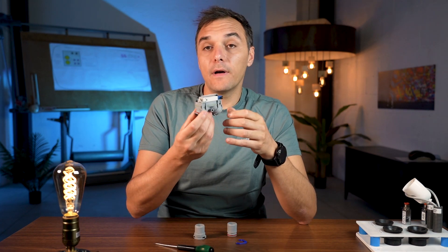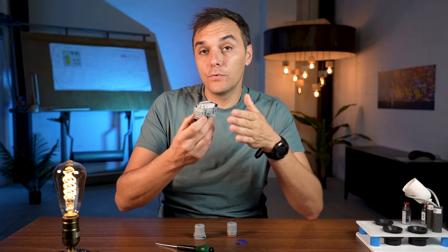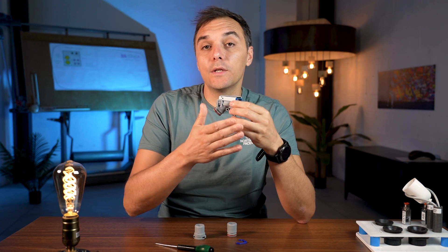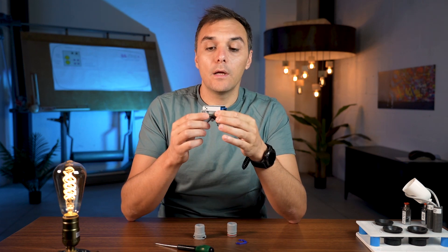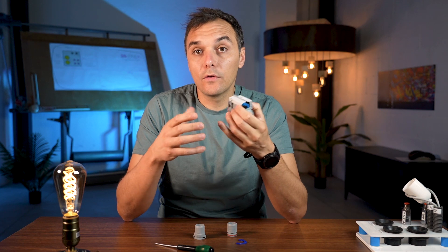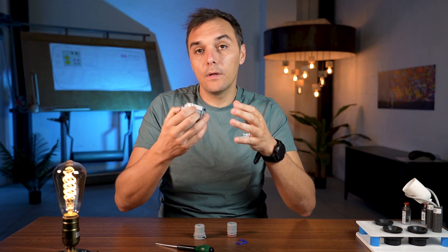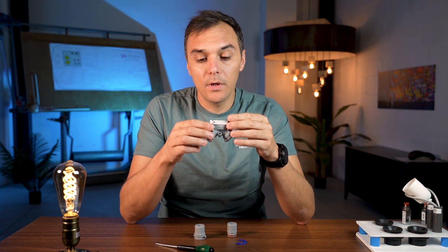Basically this valve stops suction from one tube to the other. So when you are using one dental chair the other one stays closed, and we don't have any loss of power in the suction motor. The system closes and opens the tubing that goes to the motors.